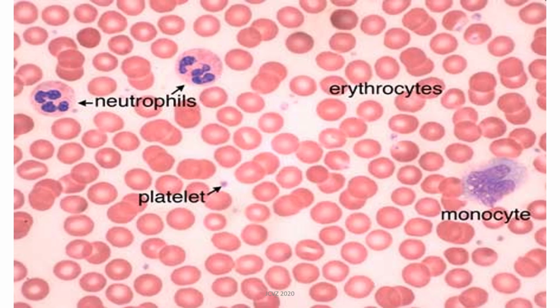Then we have our red blood cells, the orange to salmon pink in color, and our platelets that are so tiny. You would sometimes see them as dust or microorganisms, but actually they're just platelets. They're so small that sometimes you neglect them, but they're there, and they play a vital role in our body.